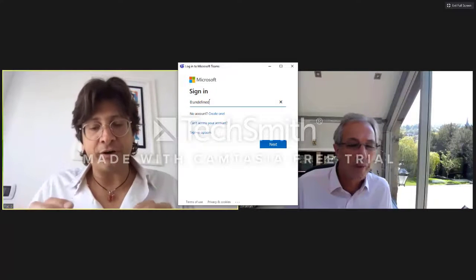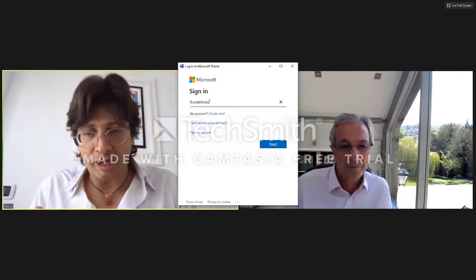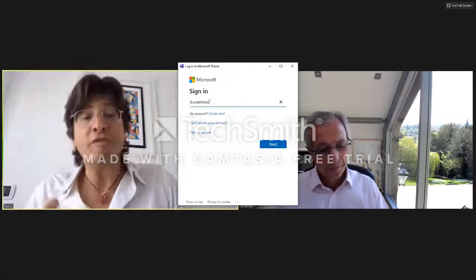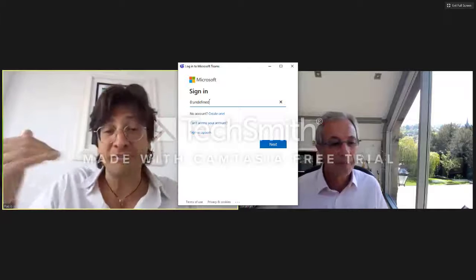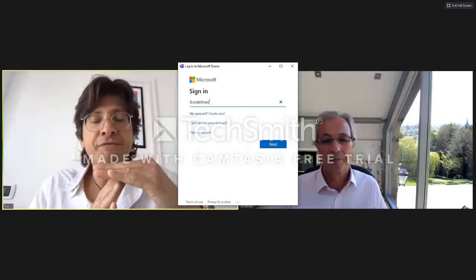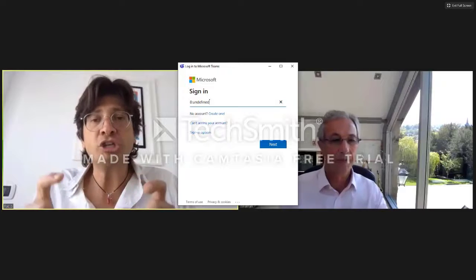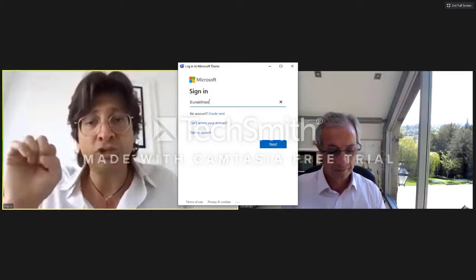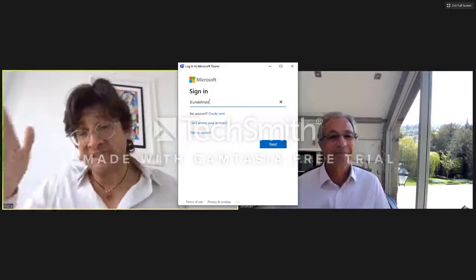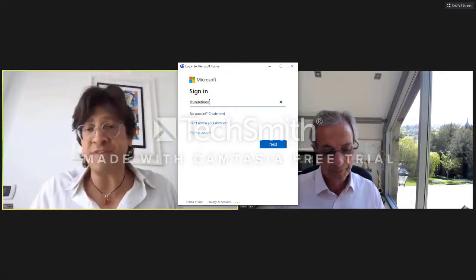The amount of reduction of the bone and gingiva is based on a functional evaluation, because if you do too much, you have food impaction in the patient, horizontal food impaction, even if you have closer contact points. If the shifting of the gingival bone produces too much space in the embrasure, too many black triangles, you can have horizontal food impaction. So you have to evaluate this from an aesthetic point of view. You can settle and manage this with the digital workflow, for example, which is very useful.